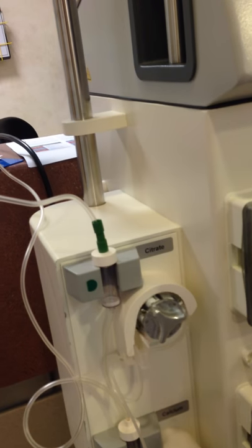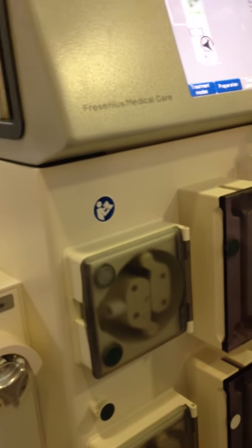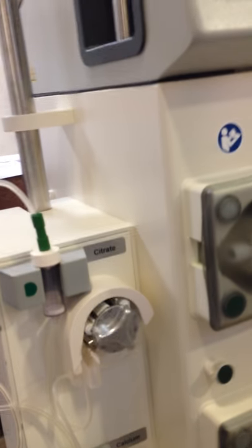What stage are we going to do this? First stage. Saline. So still that one is clamped, even though this one is clamped. Please clamp. So that's the secret. Clamp everything, because the machine will tell you when to clamp and when to break the cone.